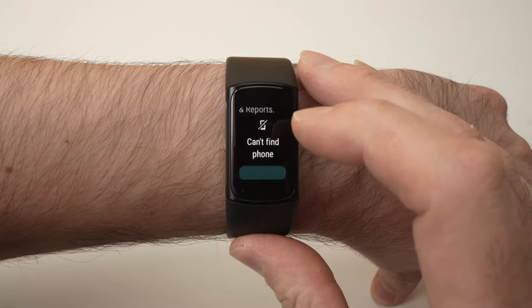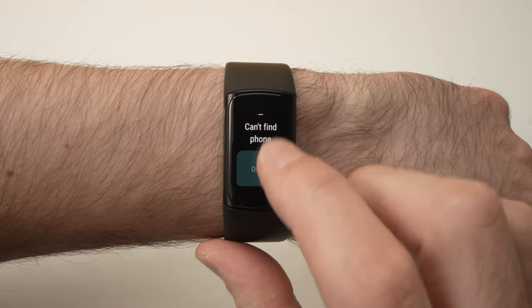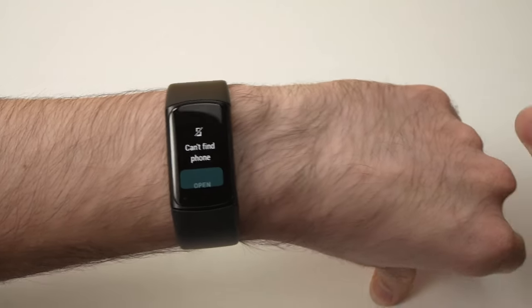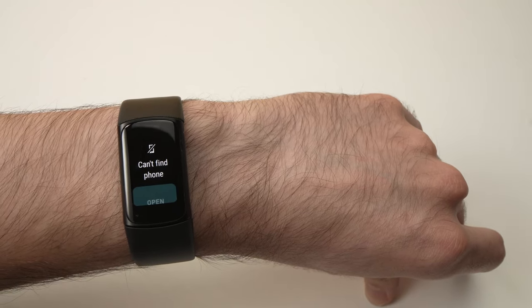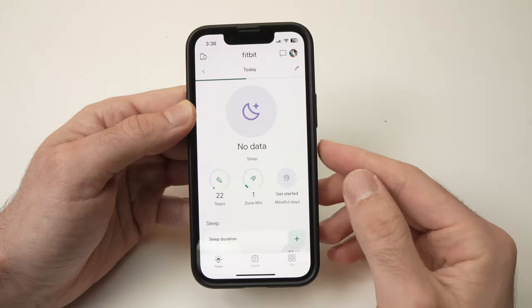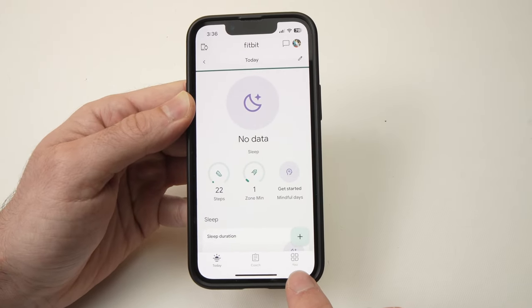From here I'll go down and usually you should find the open button here, but it cannot find my phone although it's just beside me. The open button is not available, so just go on your app and go over to where it says 'You'.